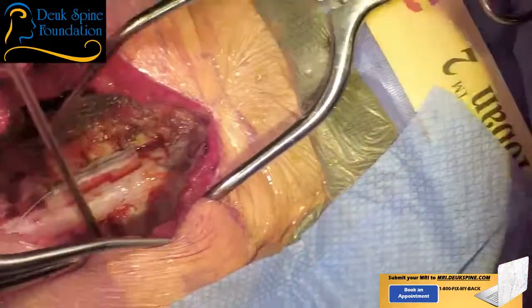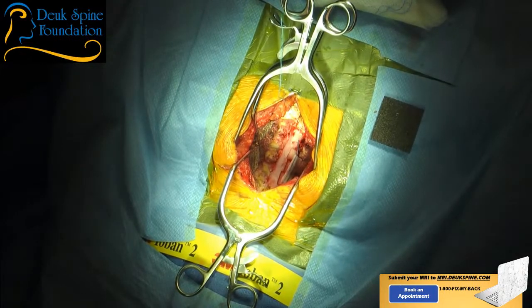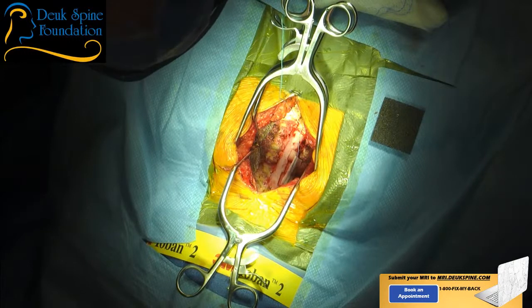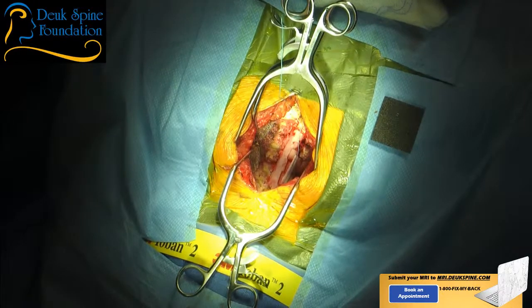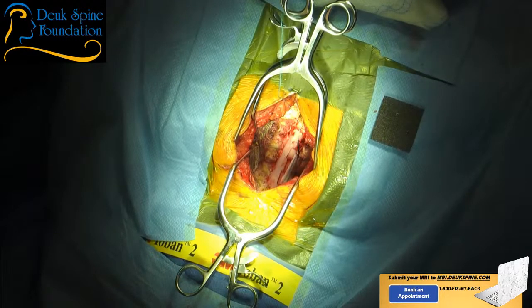All right, I'm going to switch sides. Dr. Atwater, you're welcome to look in. You ready? I'm coming down. So I'm going to go back to my side, which is the patient's left. Be careful, Dr. Atwater. You can see the spinal cord, the dura. We've decompressed the central canal nicely. And now we're going to open the foramen up where they're narrowed in the back. And we've already done our proximal foraminal decompression with that osteotomy.